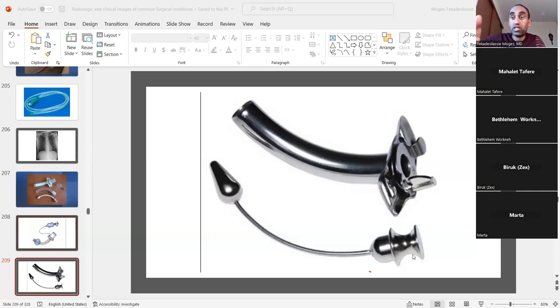If you keep it there, after you introduce the tracheostomy, let's assume you forgot about it, then what will happen to the patient? Well, there's no point in the tracheostomy. So what will happen to the patient? Straightforward? Suffocate. You are suffocating the patient because there is no air entry. You have introduced this tracheostomy tube and then you blocked it, another airway obstruction. So the obturator has to come out immediately. You have to take it out, okay?